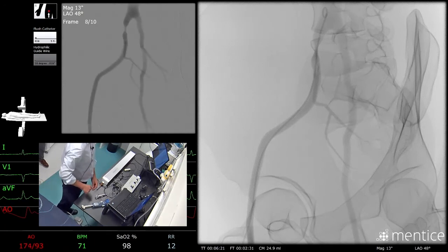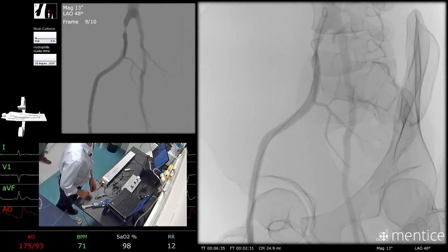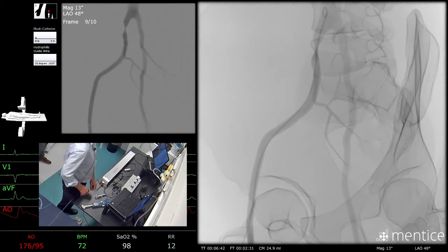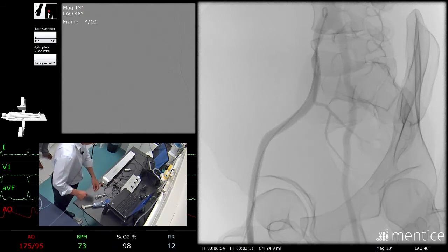We know in the old days they used to put calipers on these angiograms to measure the diameter of the normal vessel to estimate what size balloon you would use, and typically they'd oversize about 10 to 20% in the old days, going off the angiographic information. Now though, with CTA you do exact measurements from the vessel, and from this patient's CTA we know that it's roughly a 10 millimeter proximal common iliac vessel, so a balloon between 8 and 10 millimeters would be appropriate, I think, in this case.